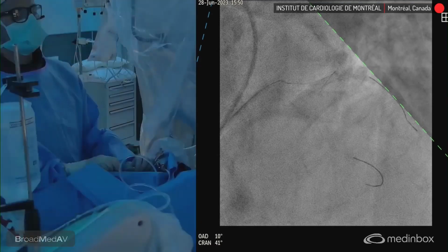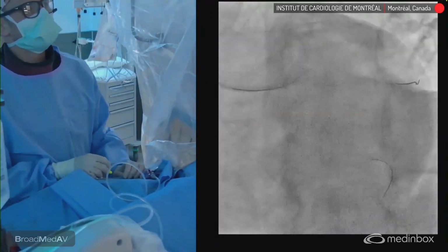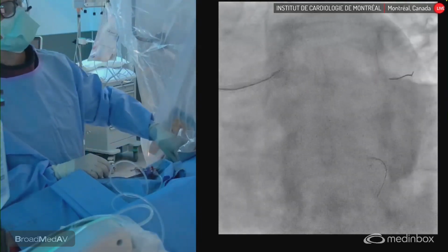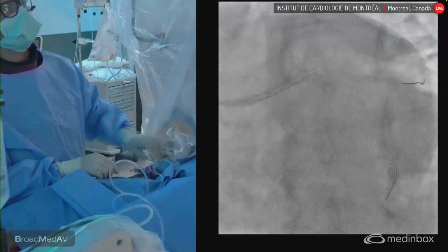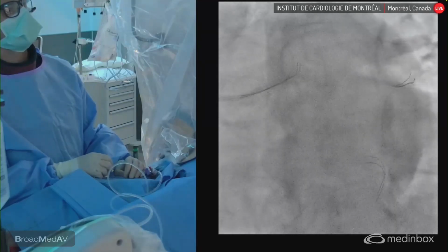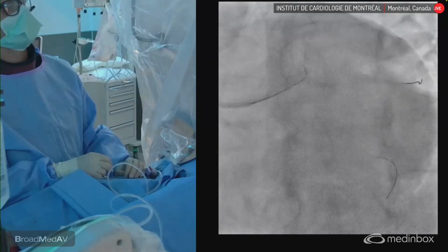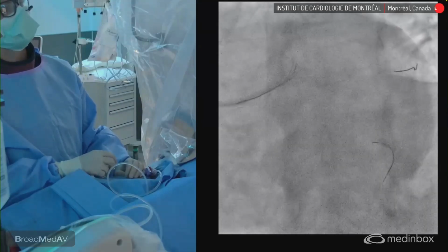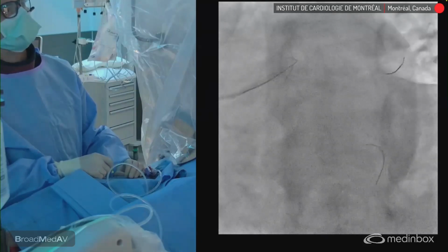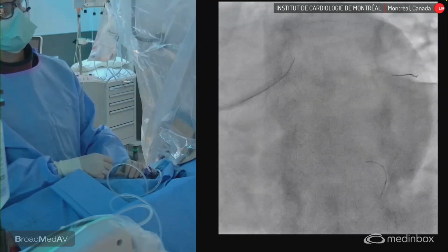Well, that's great. I think it's going very well. Everything is under control. The pressure is good. The patient's doing very well with that mild sedation. And now we're going to go into the LAD. The guide is committed to the circumflex. We may push it a bit, push a bit on the guide, to go to the LAD. Up, you're almost there. Excellent. Turn it maybe a bit to another side. Sometimes you twist it, you're getting there. It's prolapsing, collapsing, I see that. Are you in the LAD or on a small branch maybe, I don't know?